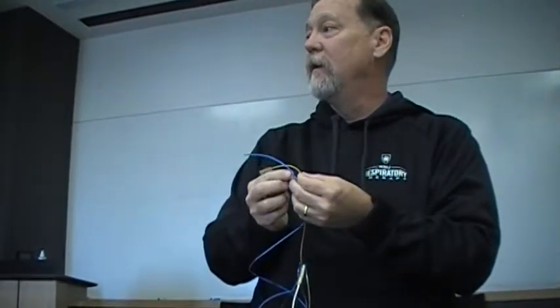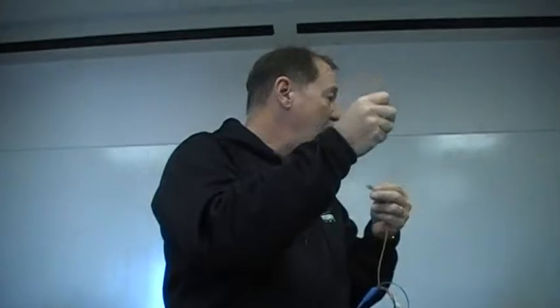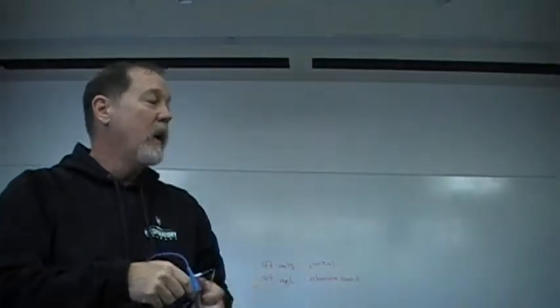We can look and see what oxygen consumption is. That's pretty powerful, right? So we work with this catheter, and we'll draw blood and put it in a machine and measure the PO2. And it tells us a great deal about mixed venous.